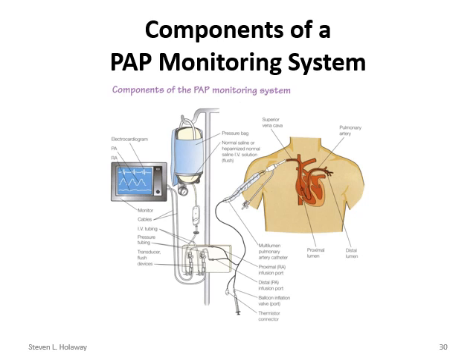This is called an introducer, or some places will call it a cordis, and that had to do with a brand name. But basically, this is a large bore introducer device that goes into the superior vena cava or to the right internal jugular.